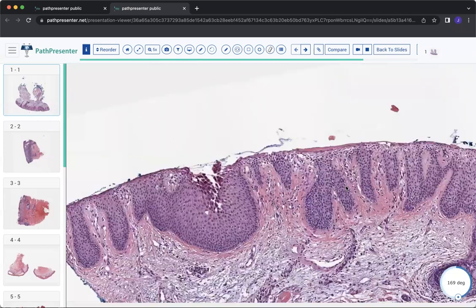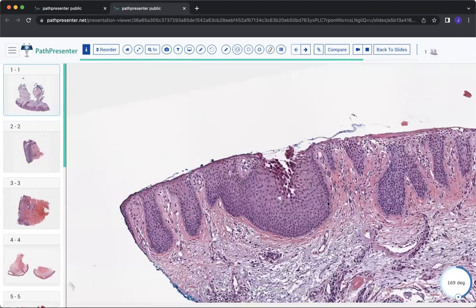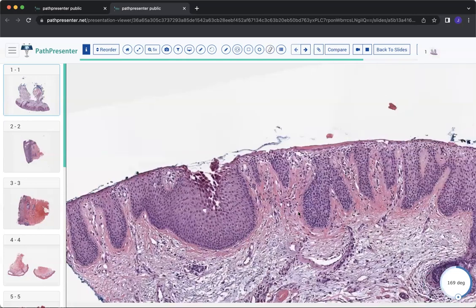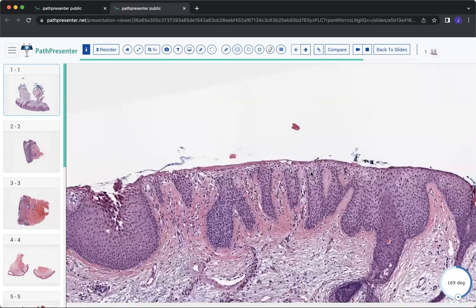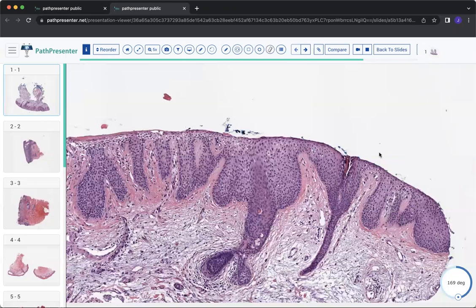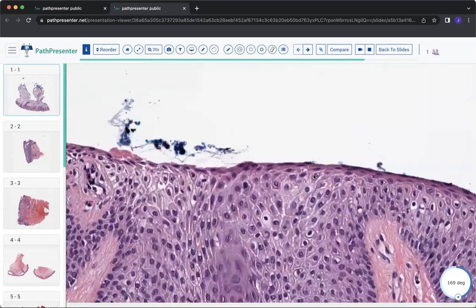So on direct immunofluorescence, let's say you took a sample perilesionally to this lesional sample, and you got an IgG pattern highlighting the region in between the keratinocytes in the more superficial aspects of the epidermis. So what's your diagnosis? If you're thinking pemphigus foliaceus, you're correct.